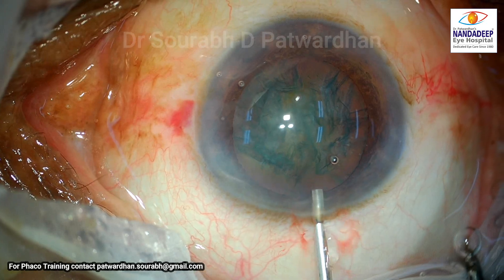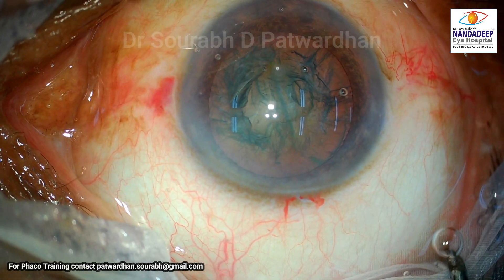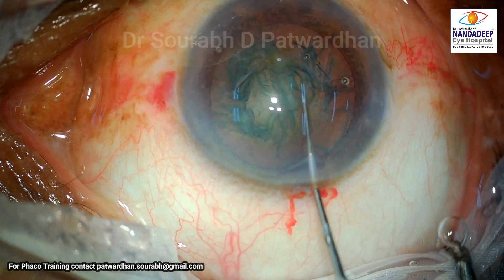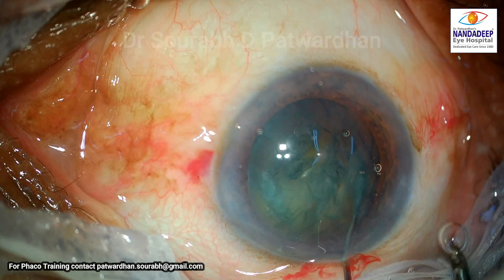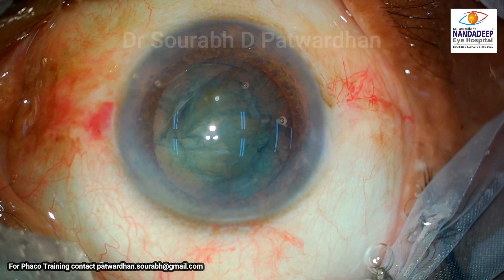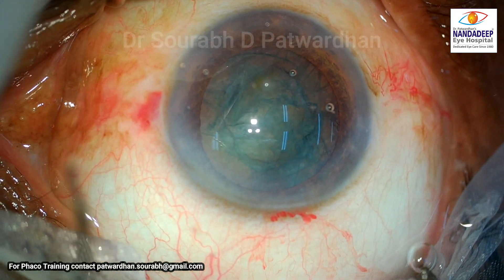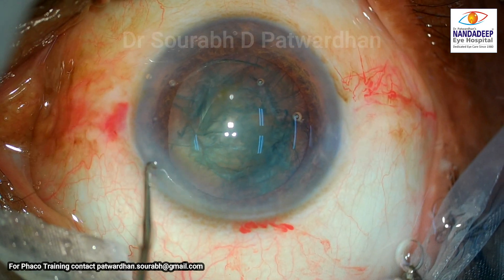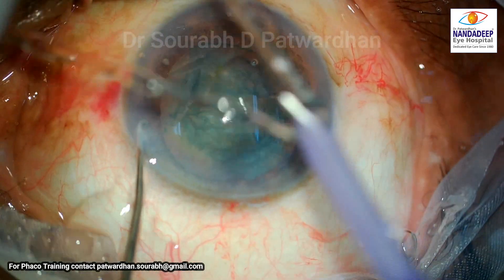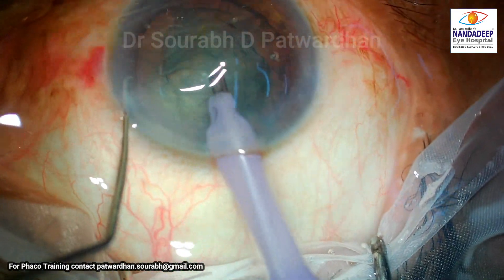The surgeon reforms the anterior chamber with OVD, which is very important — before doing nuclear rotation, it is essential to have a nicely formed anterior chamber. The nucleus is rotating well. For beginners, I would suggest rotating it at least four or five times on both sides to help with good movement of the nucleus and to release some cortex.